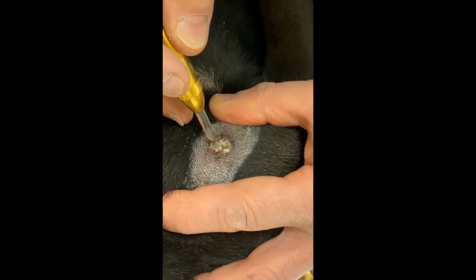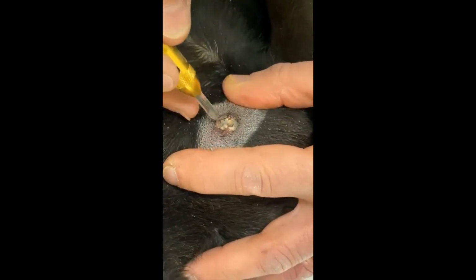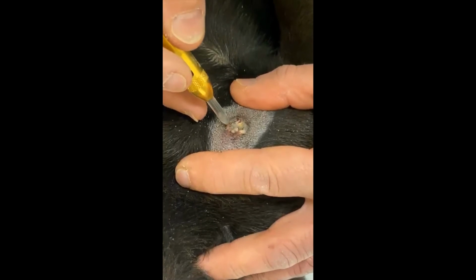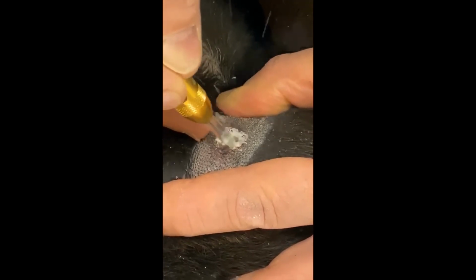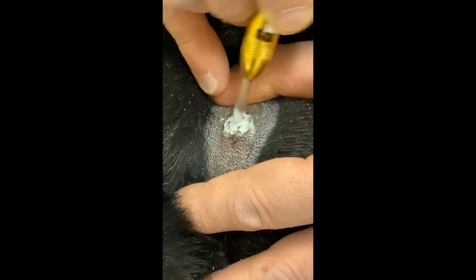It is a requirement of the freeze cycle to freeze the tissue as quickly as possible, which will form ice crystals and therefore subsequent rupture of the cells associated with the mass. So again, we're going to freeze, knocking off ice crystals as we go, so as to make sure that the gas is in direct contact with the mass.